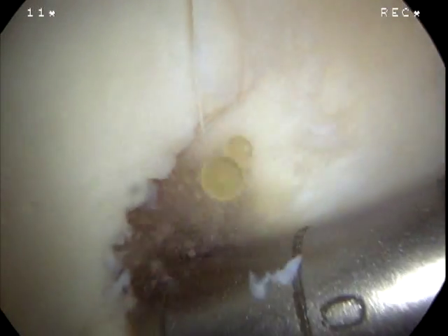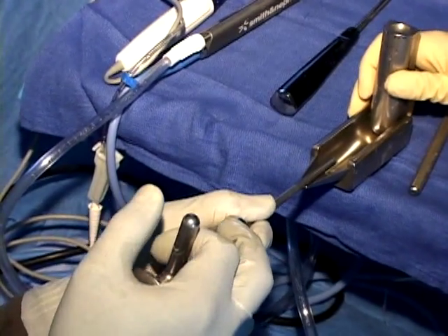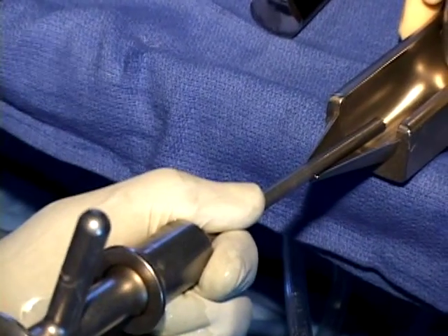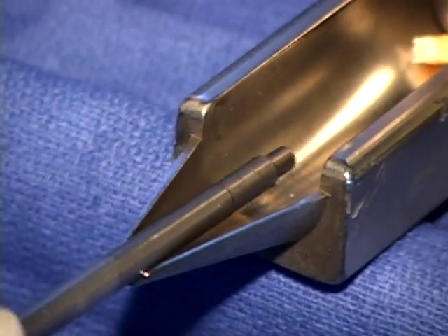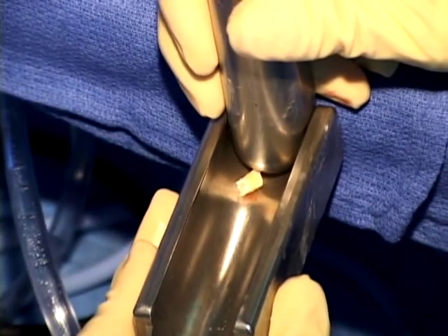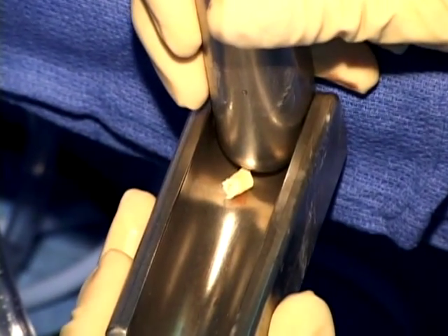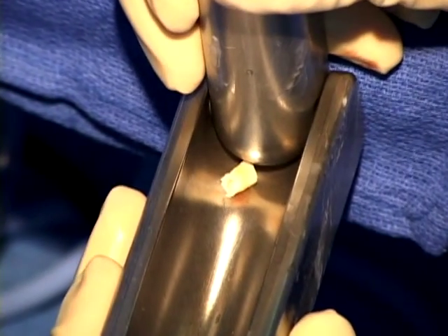We have demonstrated in laboratory studies with Tony Radcliffe that this cartilage and underlying bone has stem cells that will follow a chondrogenic pathway when stimulated. The bone and cartilage plug is passed into an ENT bone compressing unit made by Richards, which is a bone compactor that permits smashing the bone into a paste.